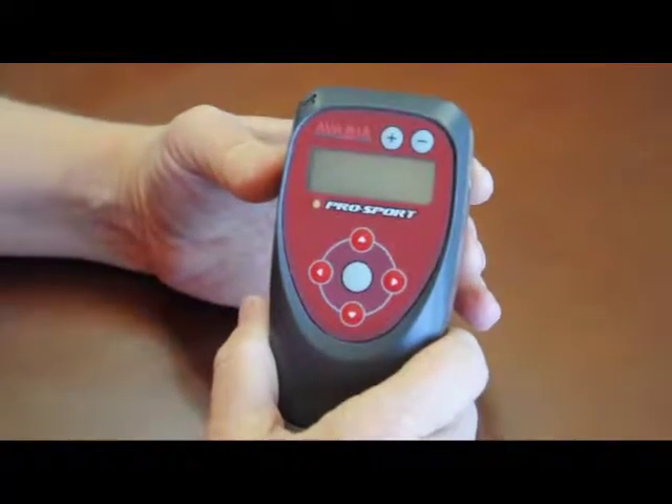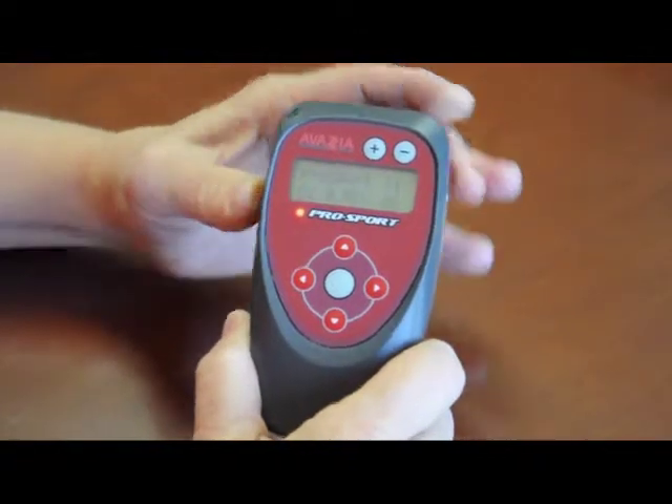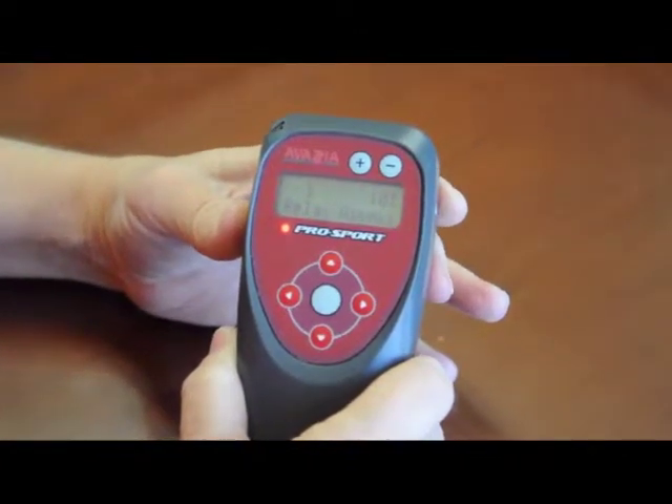With the ProSport we're going to demonstrate calibration and the need for calibration. We turn on the device and it comes up in the default setting.